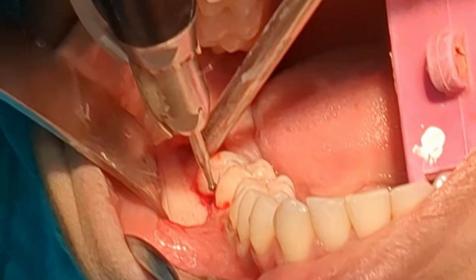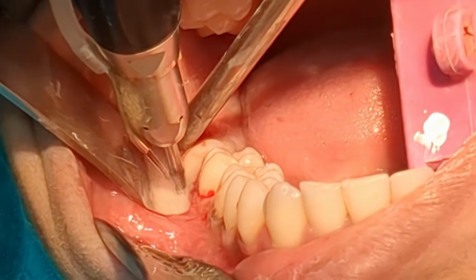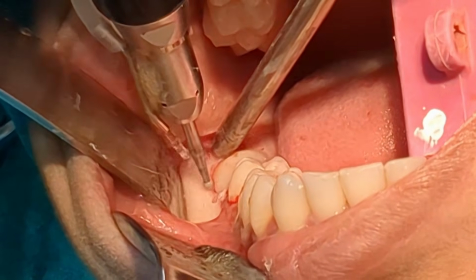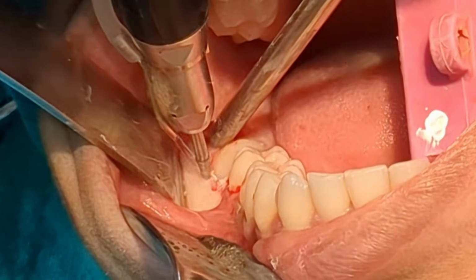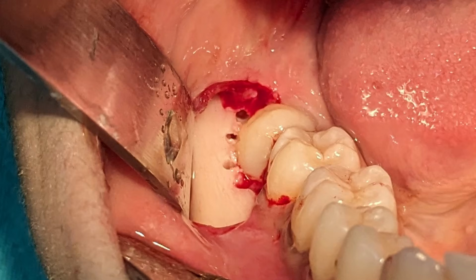I create ditches in the buccal and distal bone with an HP6 round burr. This is how the ditches look.